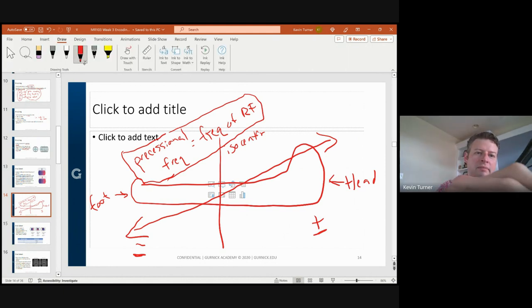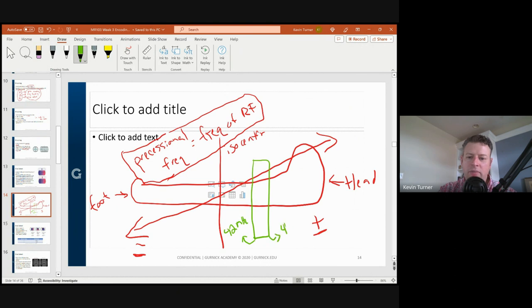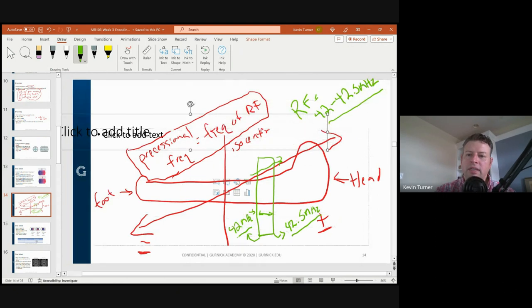So when we're scanning a patient, we now turn on the gradient and change precessional frequency, and we say, okay, in this part of the patient's body, let's say this end of the slice is at 42 megahertz and this end over here is at 42.5. Because this gradient is going across this part of the body, the protons at this side of that line are going at 42. And then in between these two lines, the protons are all going between 42 and 42.5 megahertz. If I send in my RF pulse, and I send in RF pulses between 42 and 42.5 megahertz, then only these protons become excited.